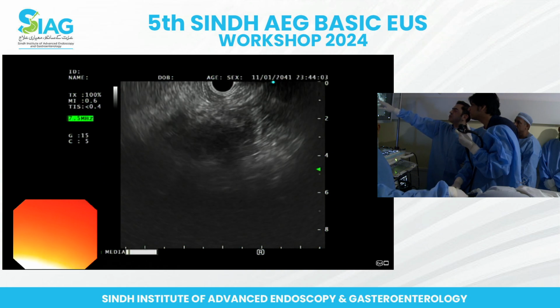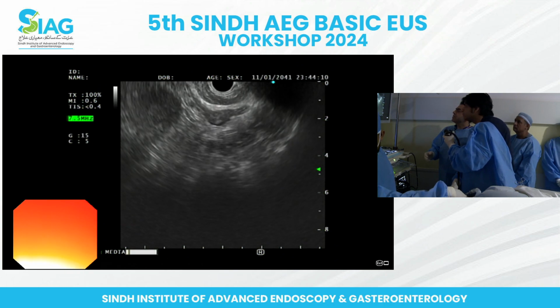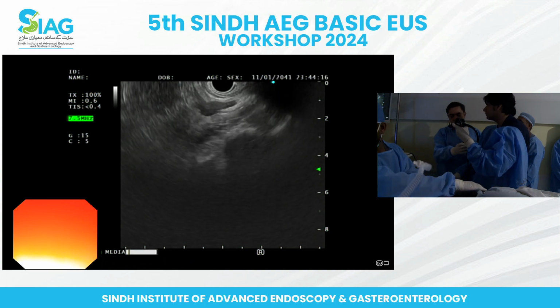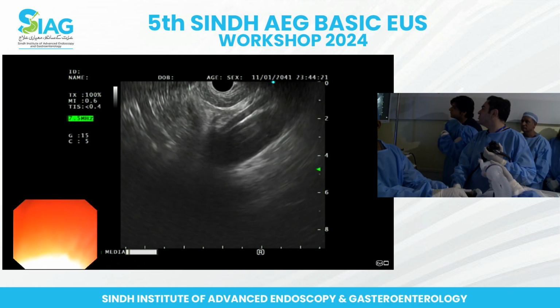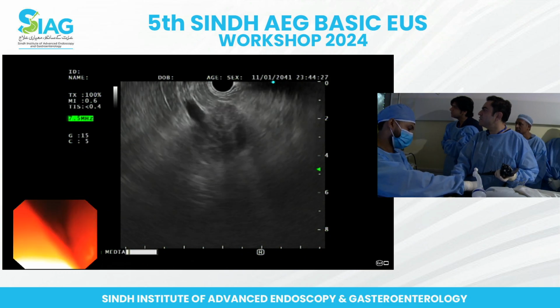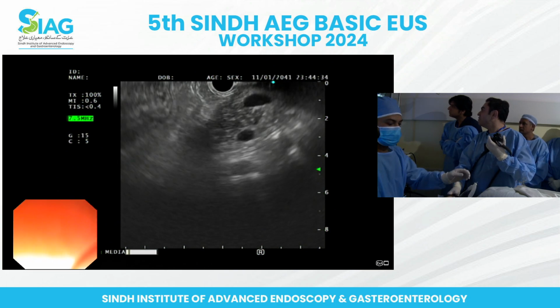So the pancreas tissue is up on the top. So again, the seagull sign that you're bringing up, yeah? Okay, let me have a look. We're not getting very good images, are we, here? So just getting back to the aorta, and I'm seeing if there's probably a bit of hernia there. That's why your scope is not moving. Your scope tip was, I think, stuck in a hernia. So that is why when you were trying to push it in, it was not going in.